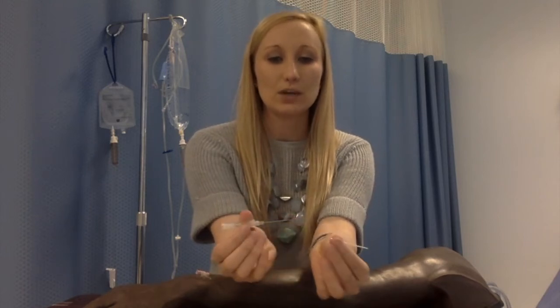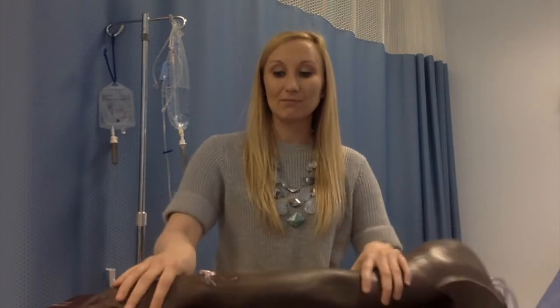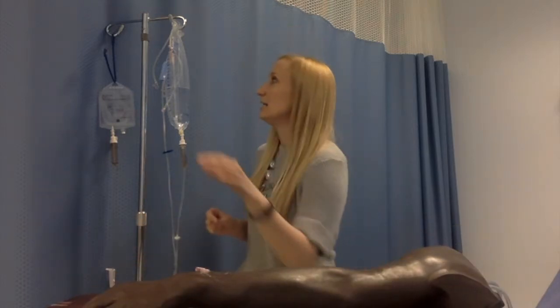When you start an IV, what you have is a cannula that the needle is going through. So once you insert the needle and the cannula into the patient, the needle actually comes out. All you're left with is this flexible, pliable cannula that's left in the patient. So that is what I have here in my patient, is the cannula. So I just want to give a little background for that.